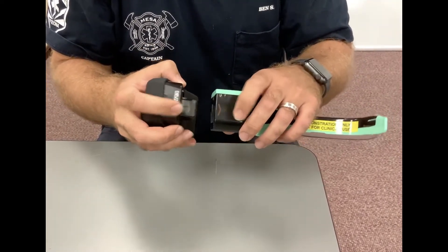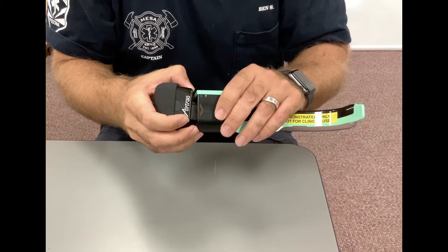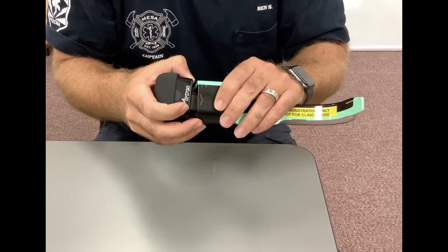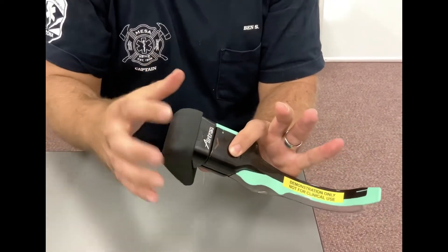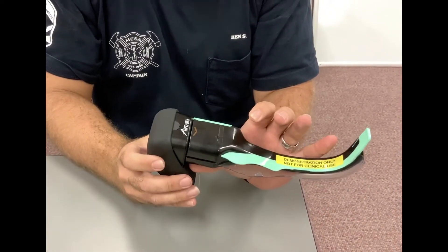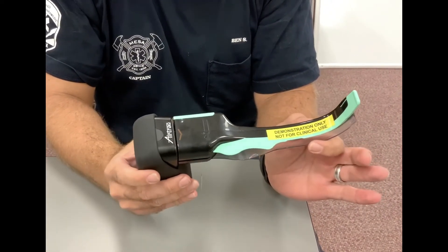So just line the arrows up and push it over as far as you can towards the channel side, then slowly insert it and you'll have a nice tight fit with these new cameras. Let EMS know if you have any issues and we'll walk you through it. Thanks.